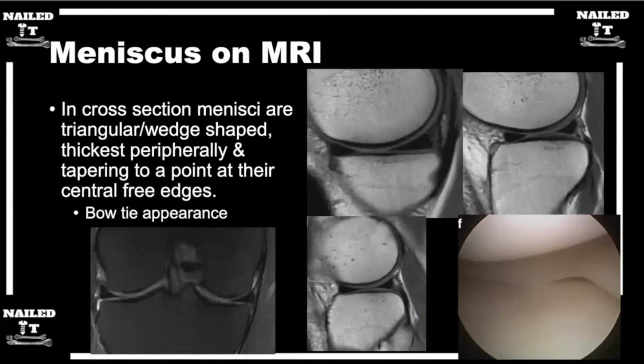That's right. And again, on that picture you're showing, you're more peripheral because you see the fibula sneaking in on the bottom. That guides you to ask, if I've got this one image, where am I in space? You're peripheral because those triangles are getting ready to touch. You're peripheral because the fibula is sneaking in, and you're lateral because you're at the location of the fibula, in addition to the convexity of the tibia here instead of the more concave nature of the medial side. All of those clue you in to where you are in space, because on a single sagittal image, sometimes it's hard to tell.